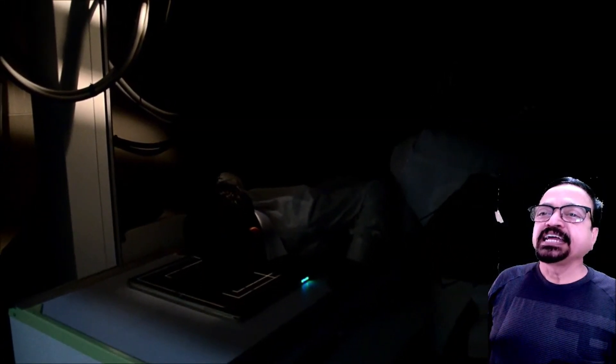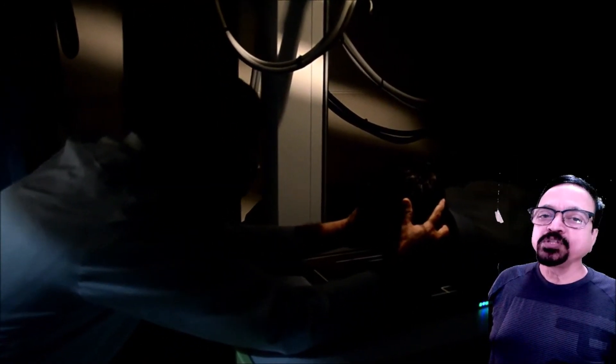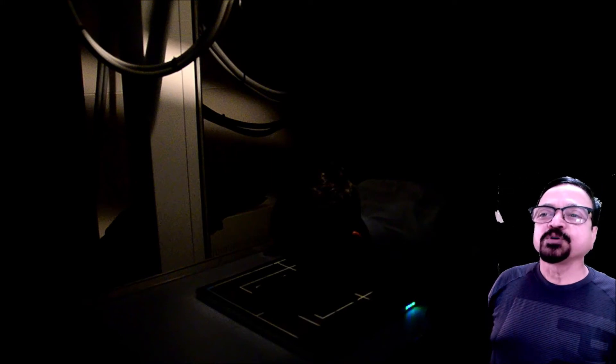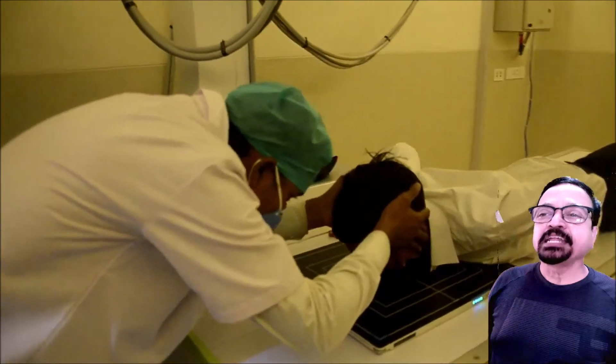The distance should be 100 centimeters. The patient's nose should not touch the cassette. Key technical points: patient prone, nose elevated, mouth open, distance 100 centimeters, and no rotation. Rotation should be assessed from the long end of the table, not from the side, to properly confirm the head is not tilted. Then proceed with the exposure, collimating so that surrounding parts are not exposed.